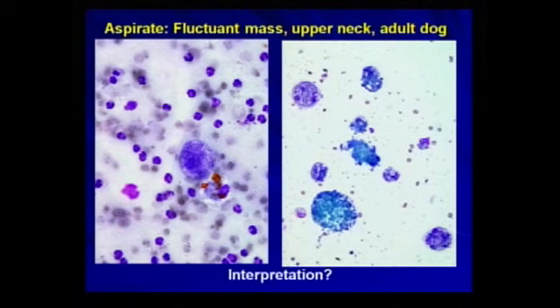And aside from the neutrophils, there were a large number of macrophages with small nuclei, and they had sort of amphophilic material, and occasionally you would see these bright orange rhomboid hematoidin crystals.